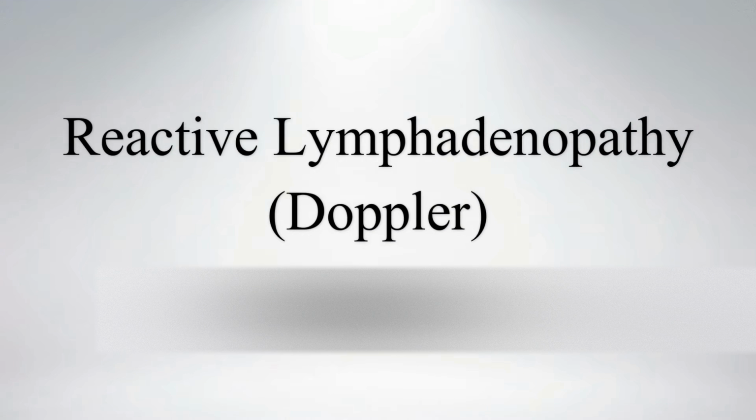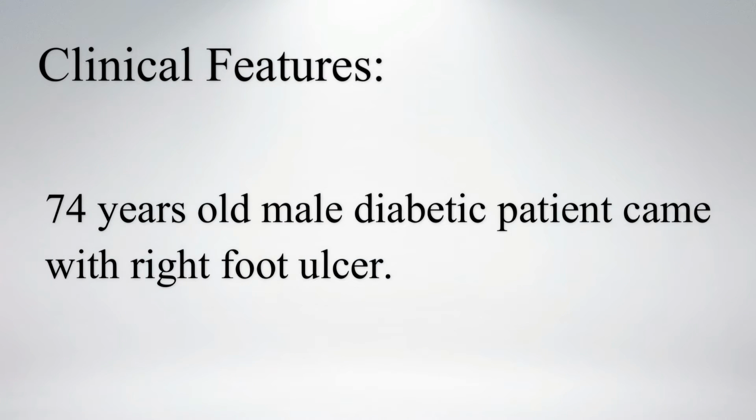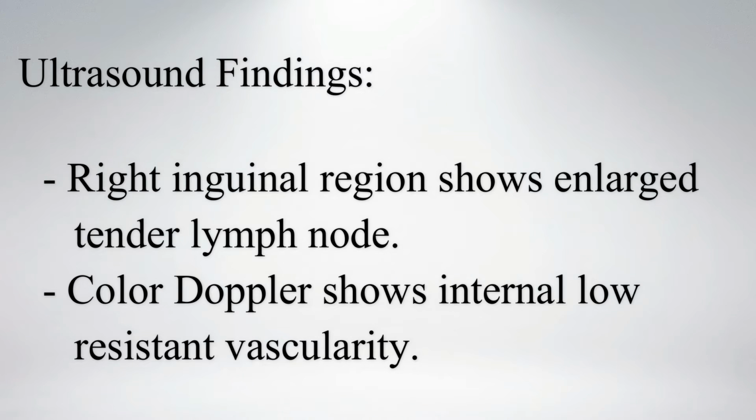Hi everyone, let's see a case of reactive inguinal lymphadenopathy. A 74-year-old male diabetic patient came with right foot ulcer. On ultrasound, right inguinal region shows enlarged tender lymph node. Color Doppler shows internal low-resistant vascularity.